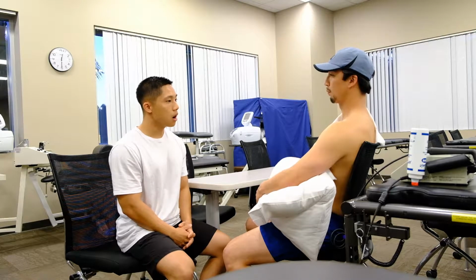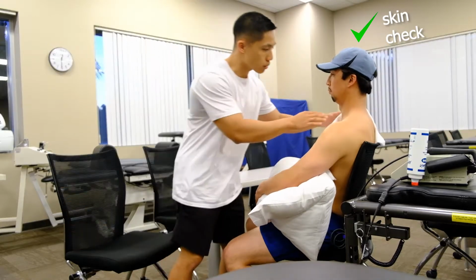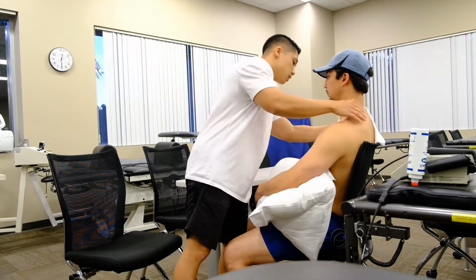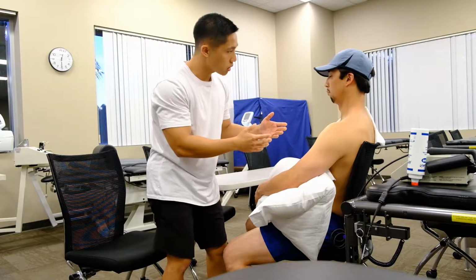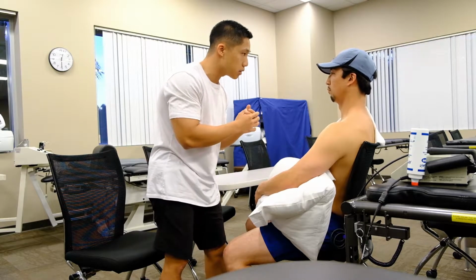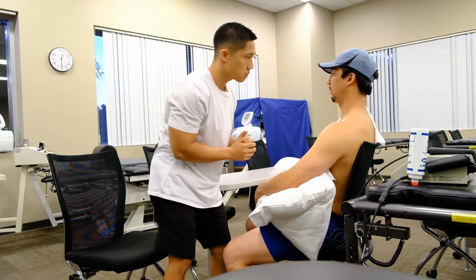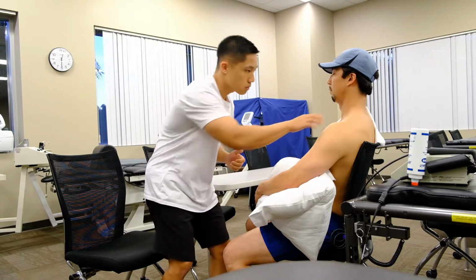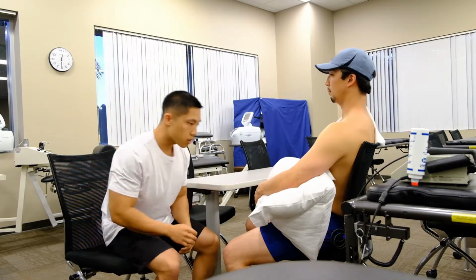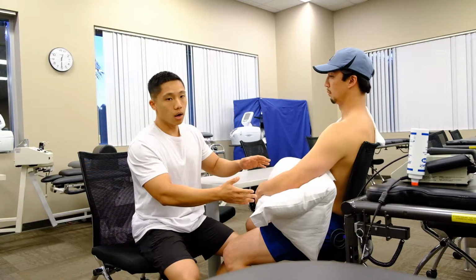Okay, perfect. Also, before we begin, I'm just going to do a quick skin inspection just to make sure everything in that area is okay. All right. Okay, looks okay to me. Okay, and then just to make sure that you have intact sensation, I'm just going to have you close your eyes and tell me when you feel a sensation on your trapezius. Okay. Yep. Yep. Yes. Okay, excellent.